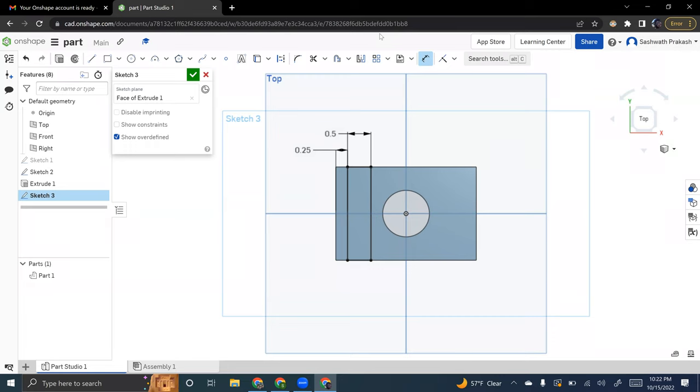Good. And then same thing for the inner of the rectangle. So how would you go about doing that? You click that one, you click that one. And then what's the other part you touch? That one, yeah, there you go. And then move it up so you can see the number, perfect. And then 0.5. Perfect, you good?